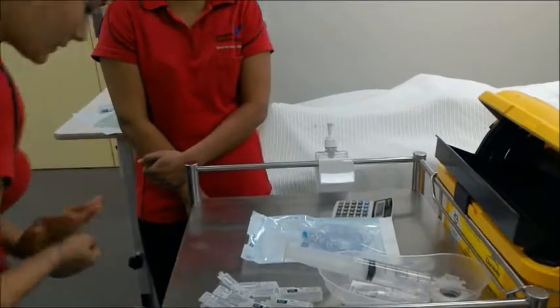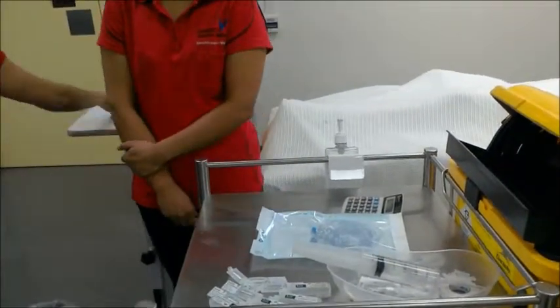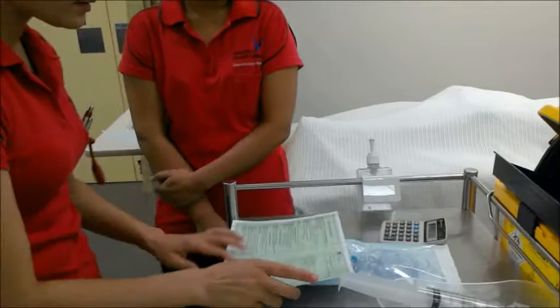Just before priming my line, I want to just do my second drug check. So, do you need my second RN to check this drug? Yes.